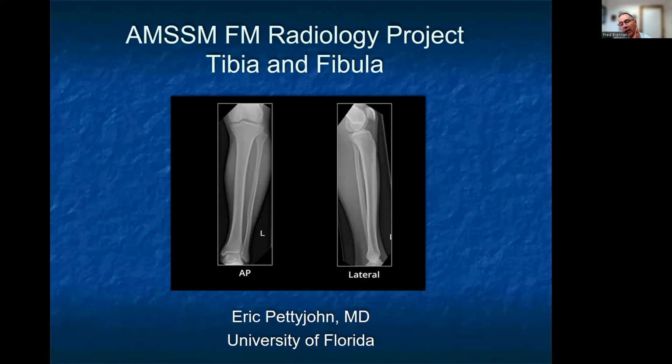It was put together by Dr. Eric Pettyjohn, who did a great job with this presentation. And so I'm going to be recording it for him. And we're basically going to go over the common findings of looking at tib-fib x-rays, a little bit of clinical correlation as well. So we're going to get started.